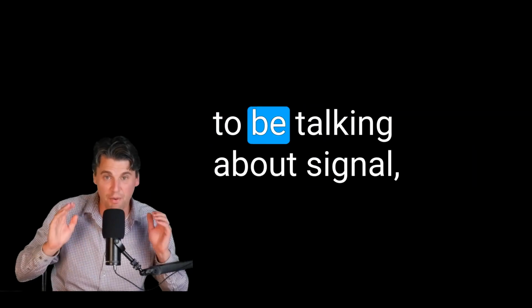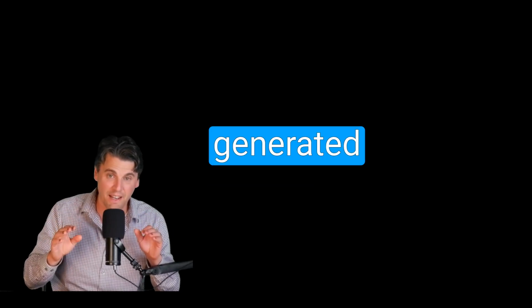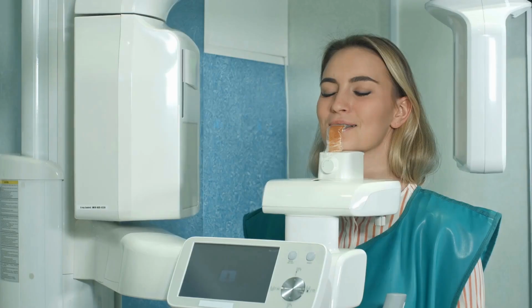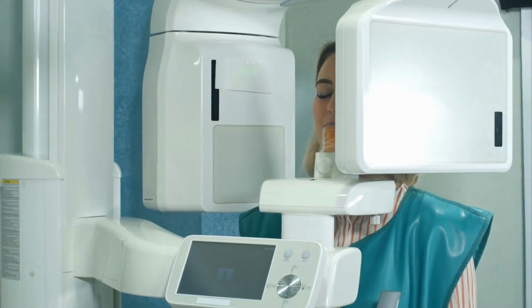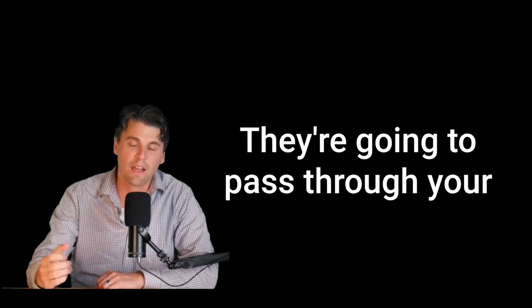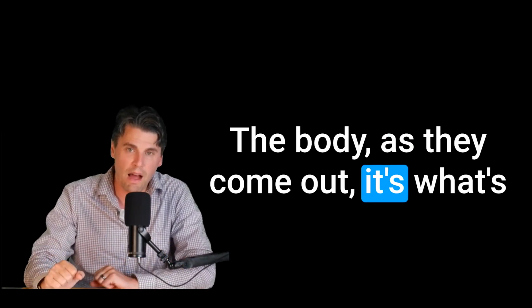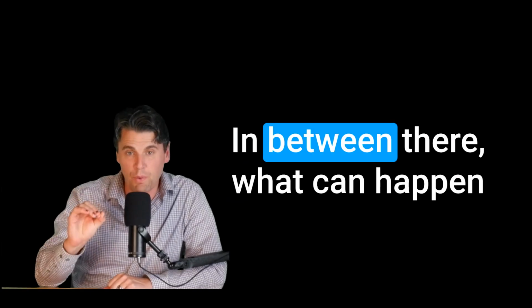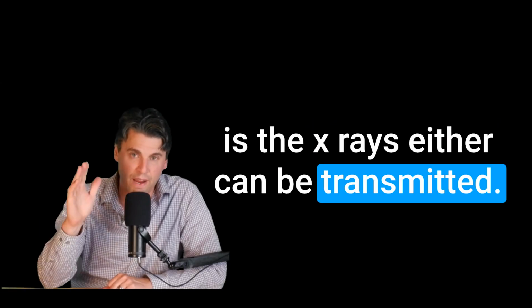Today we're going to be talking about signal, the way that contrast is generated in your X-ray and CT image. In X-ray, you have your X-rays coming out of the X-ray tube. It's what's called your X-ray beam, right? They're going to pass through the body. As they come out, it's what's called the remnant or the exit beam. In between there, what can happen is the X-rays either can be transmitted.